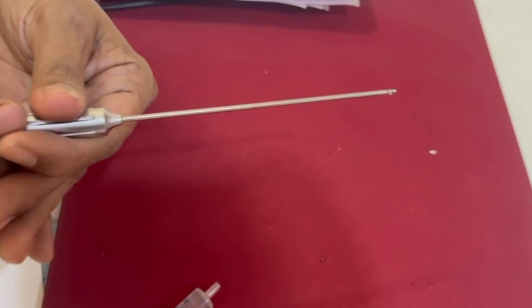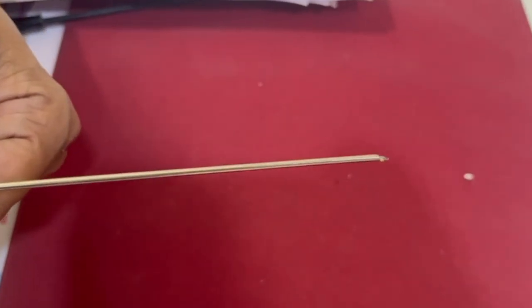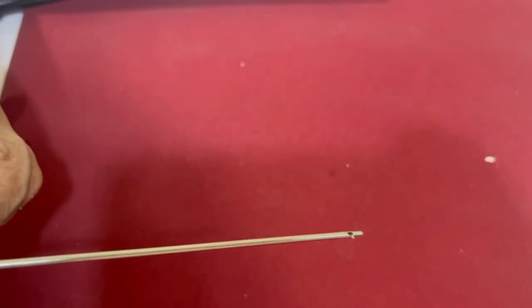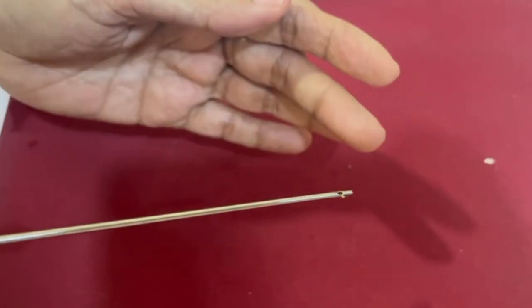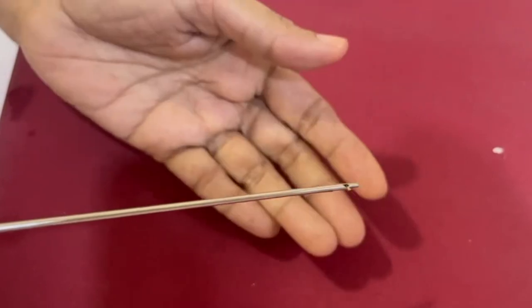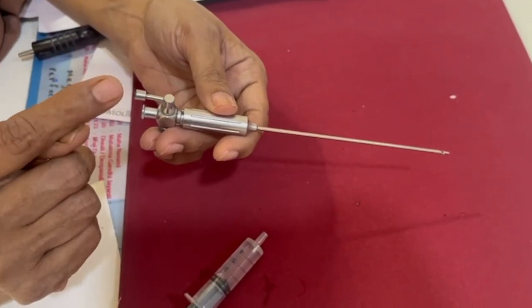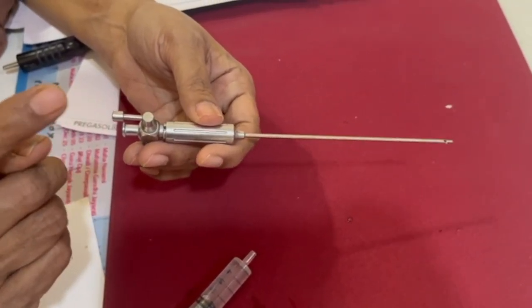When you pierce the abdominal wall, because of the spring action, immediately the sharp end goes back and the blunt end comes forward so that injuries to the underlying structures are prevented. How do we know that we have entered the peritoneal cavity safely?